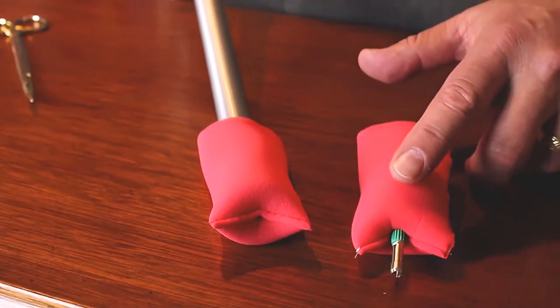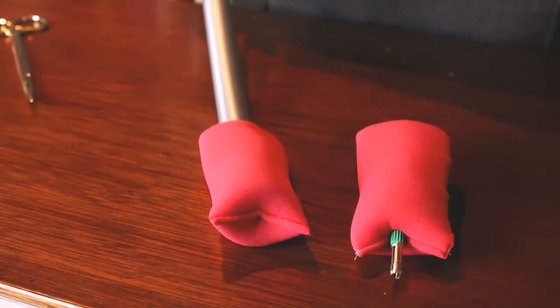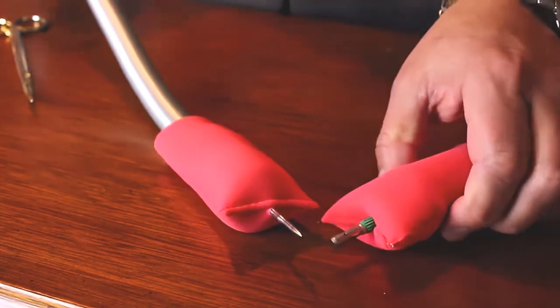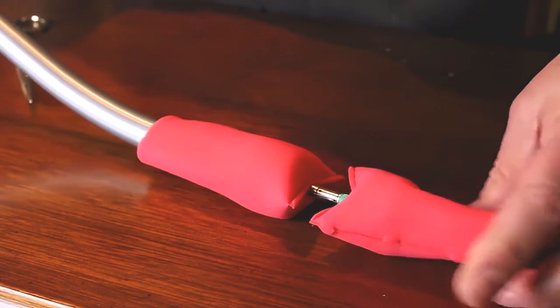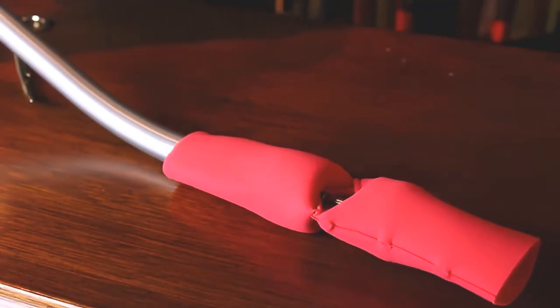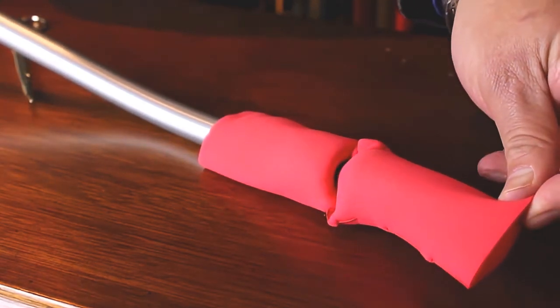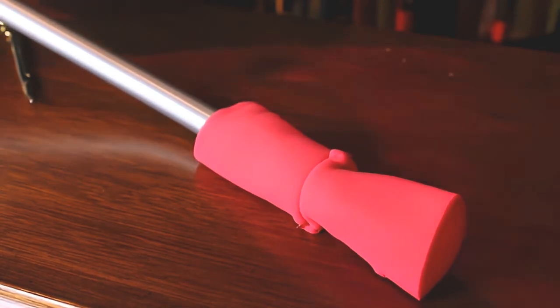The anvil has been placed on one end and already passed. Now we're going to drive the cartridge half on this side, and then these two ends will be brought together like this. The instrument is now being closed, and the two ends are now ready to be anastomosed.